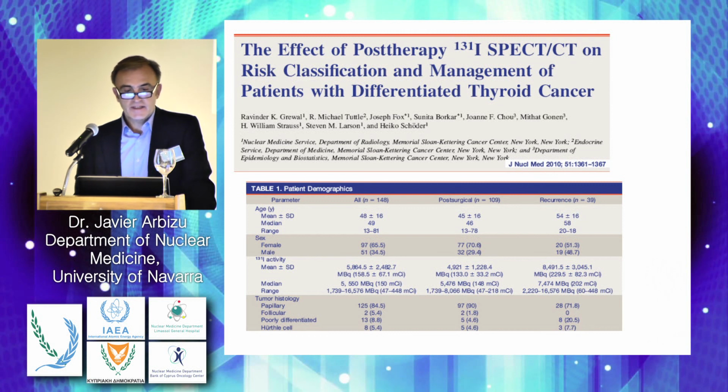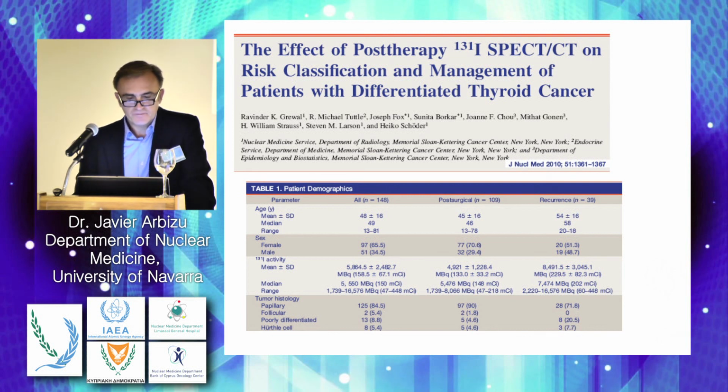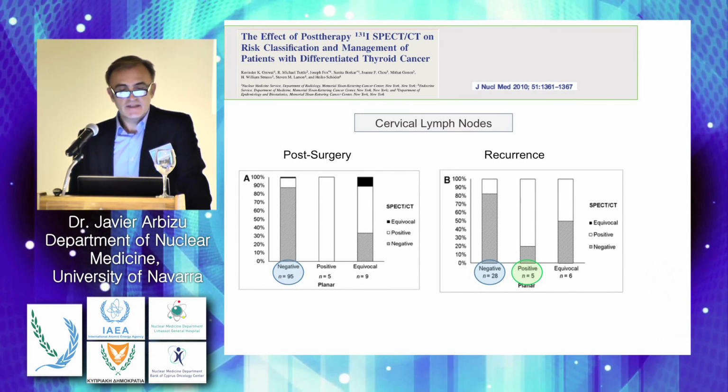Well, the risk classification has also been evaluated in different papers. This is one of them. I will summarize this later on, in post-surgical and the presence of recurrence. Here you can see the differences in terms of cervical lymph nodes, post-surgery and at the recurrence.